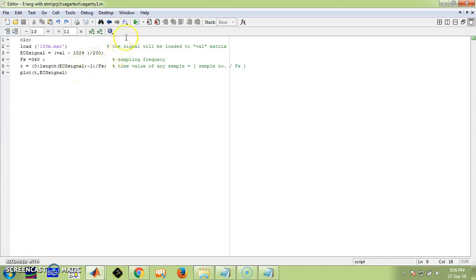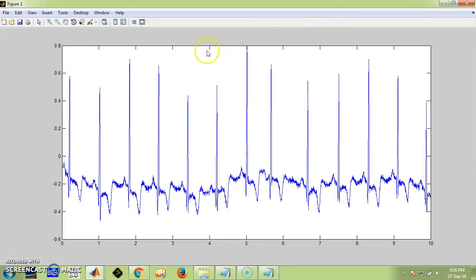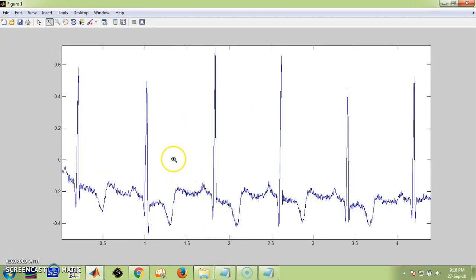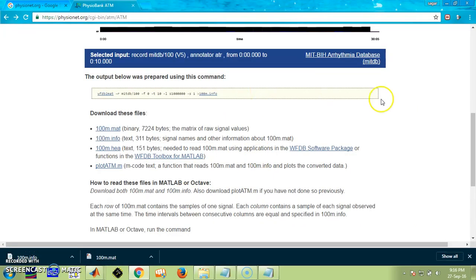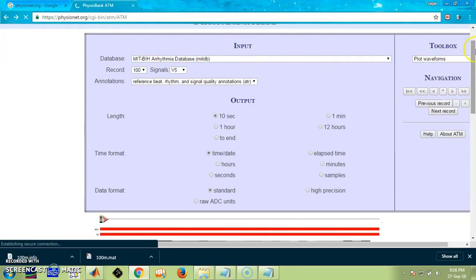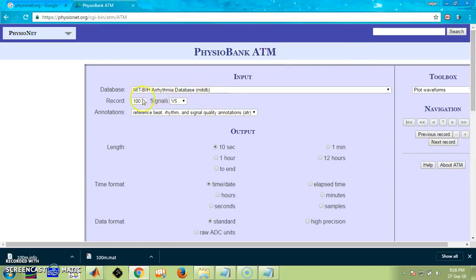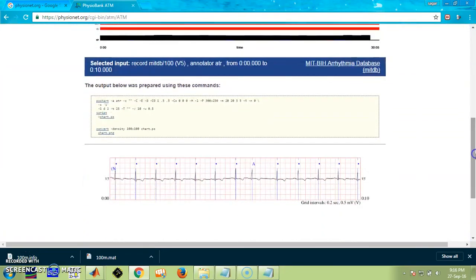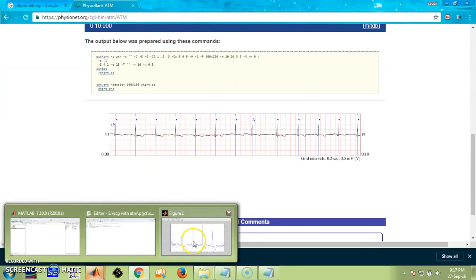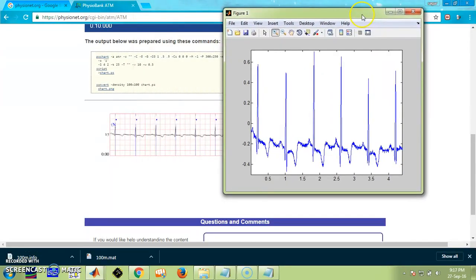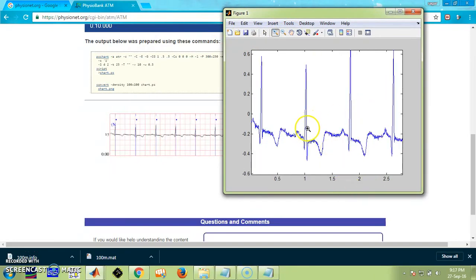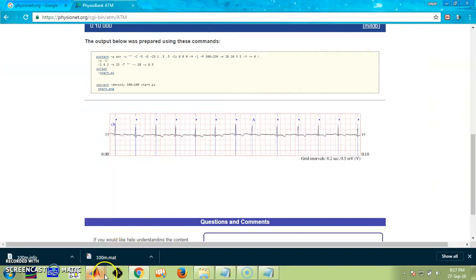Once we save the file, just click the run button, and this is the database plotted. To cross-check, I am going to show you the same database plotted in the online viewer on PhysioBank — the same record 100, V5. Here is the database in the online viewer and here is the MATLAB plot. We can compare the two — they are the same. At the start there is a small shape in both, so there is no mismatch. The database plotted in MATLAB is the exact plot of the online database.